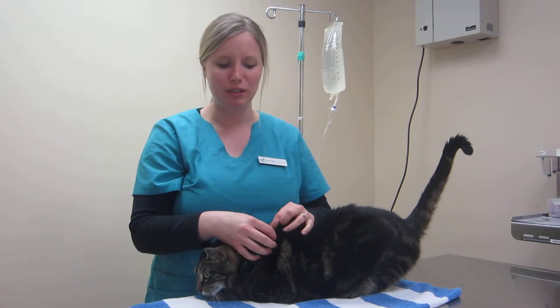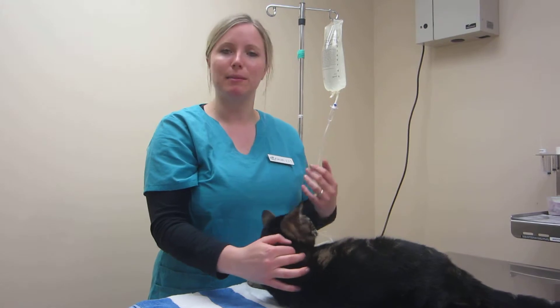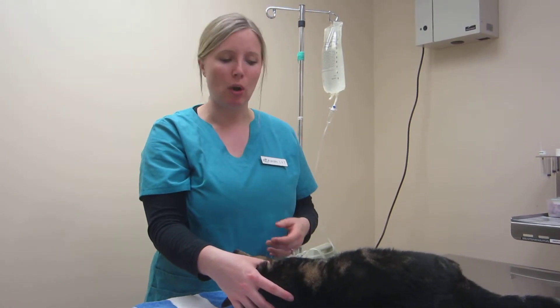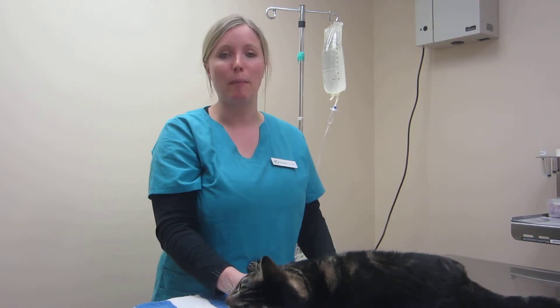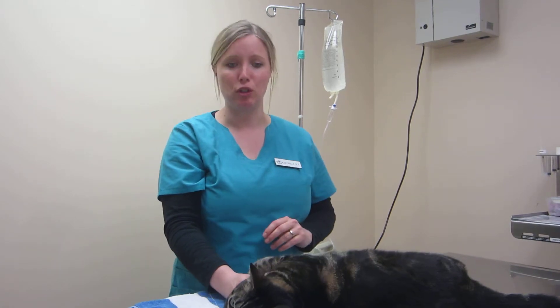Sometimes when you have a little leakage, you'll see a little blood-tinged fluid too, and that's just — could be some skin bleeders as you pulled out your needle. Don't panic. It shouldn't happen every time, but it can happen once or twice. You just take some paper towel and blot it dry, and you should be okay.